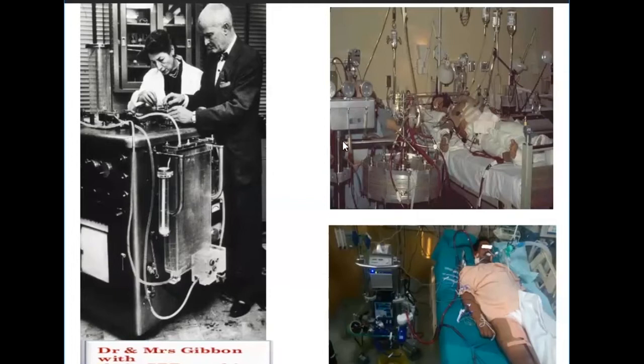And if you look here, we can see a transition from the bubble oxygenator to the membrane oxygenator, where the oxygenation type is different, but still it is very large. This was in the 1970s, when the membrane oxygenator started in practice in the operation theaters. It was not possible to transport this type of machine outside the operation theater, so there was a constant evolution. This is showing a recent ECMO. Again it is a pump and oxygenator, but things have evolved from this larger complex machine to the simple form of ECMO machines, which can be transported anywhere to the ICU, and there is no need for the patients to remain in the OT.